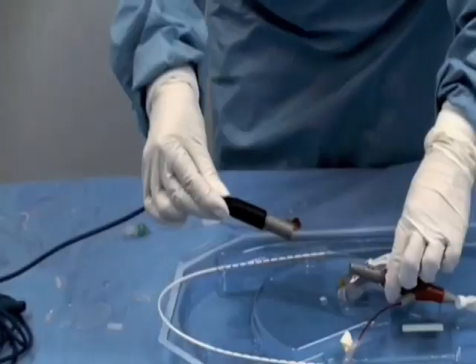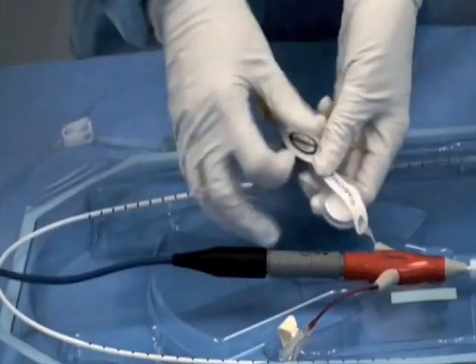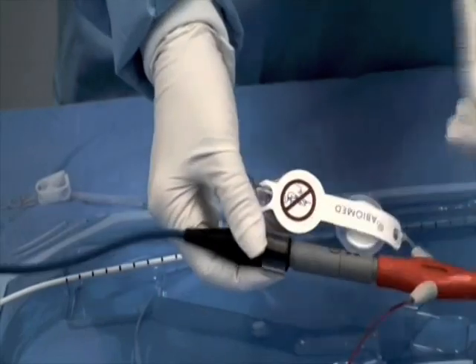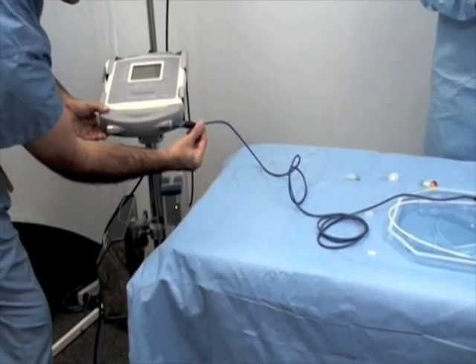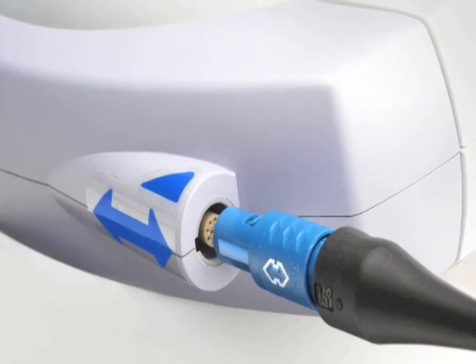Step number 2, connect. The person in the sterile field connects the gray end of the blue cable to the Impella catheter and snaps on the sidearm. The sterile person hands off the opposite end, or the blue end, of the blue cable to the non-sterile person, who then connects it to the right side of the console.